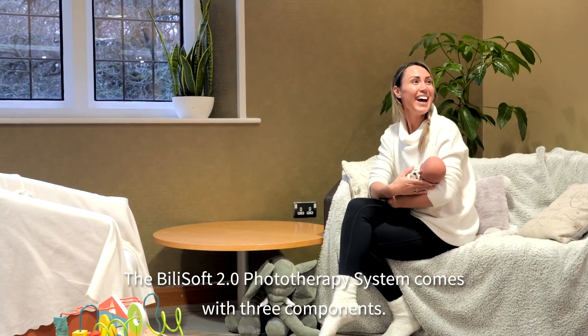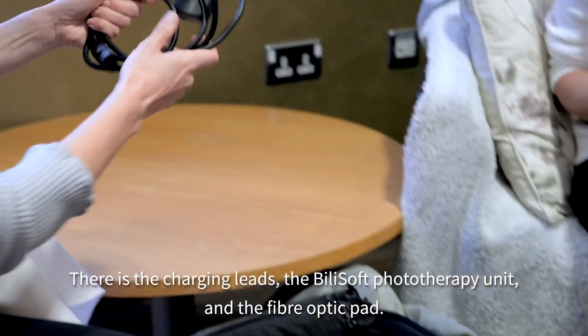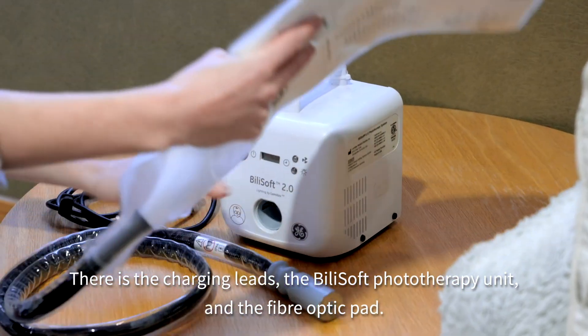The Bilisoft home phototherapy system comes with three components: the charging lead, the Bilisoft phototherapy unit, and the fibre optic pad.